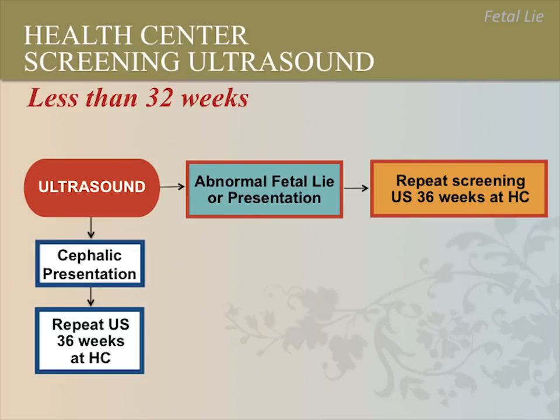Let's review these concepts. A patient comes to your health center before 32 weeks. Whether you identify a normal or abnormal fetal lie or presentation, ask her to return for another ultrasound at 36 weeks to check the lie and presentation again, because it is likely to change.